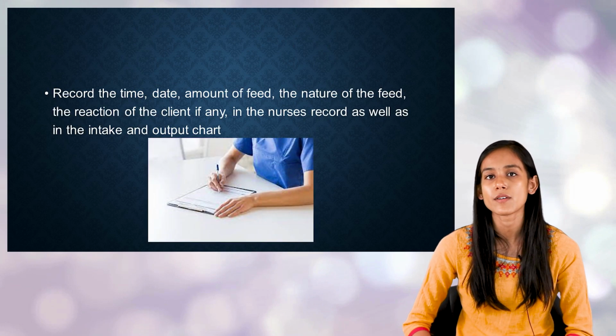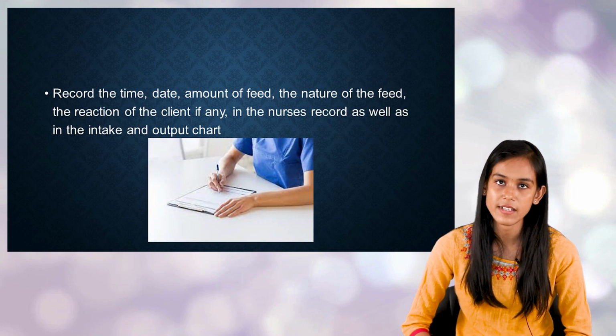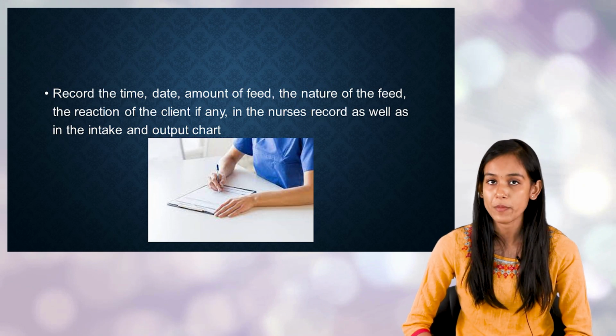And here, one very important thing is that you have to do the documentation. So record the time of the feed, date, the amount of feed, and the nature of the feed. And during the feeding, if there was any significant reaction from the patient, that also you need to document in the nurse's note, as well as the intake and output chart. So this is about the feeding procedure.